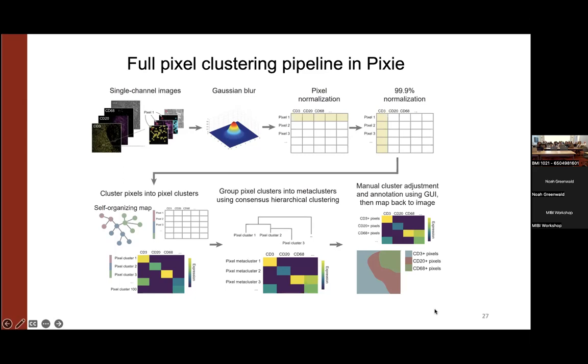We're now deciding that whatever is left in the image, we are comfortable assessing as true signal. So if you have systematic signal in there, it will confound the classification. Those things need to be sussed out before they go into any of this.